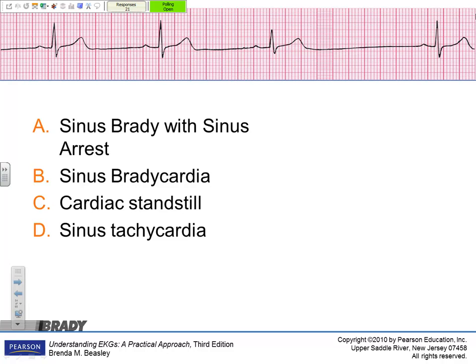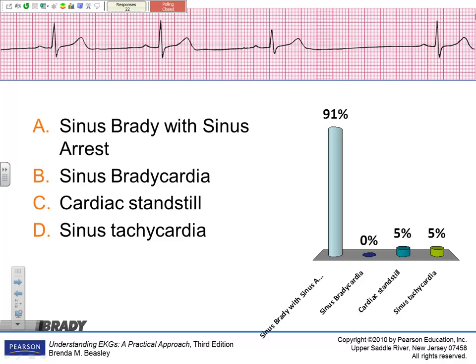Couple more. Top, top. You haven't voted, get after it. Good job. Now, one thing I do want to point out, because when we look at heart blocks a little bit later, I don't want you to be confused. This interval here, you don't have to superimpose one in here and have it be regular. It could be any length, you just know that one's dropped. Does that make sense? Some of the rhythms we're going to look at later, if one's dropped, it's still going to be really regular, so one would fit right in there without interrupting the rhythm. Here, it's going to be irregular. It's not going to be the same every time. That makes sense? Probably not.